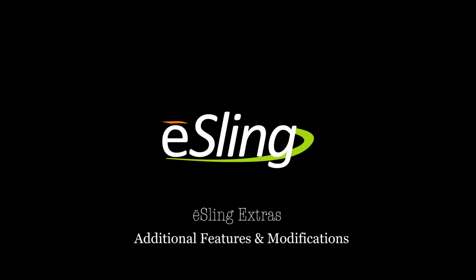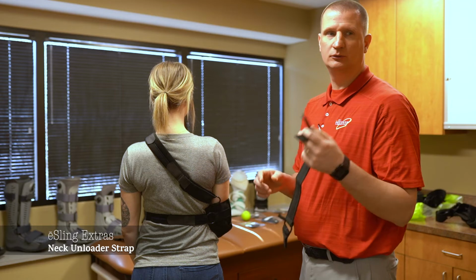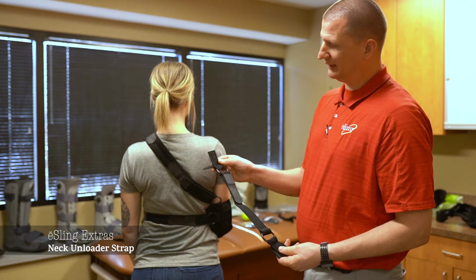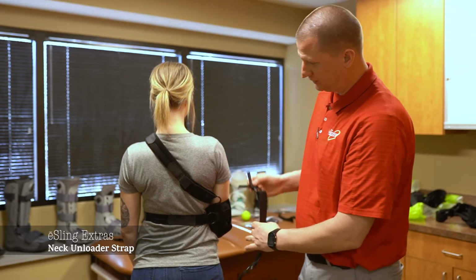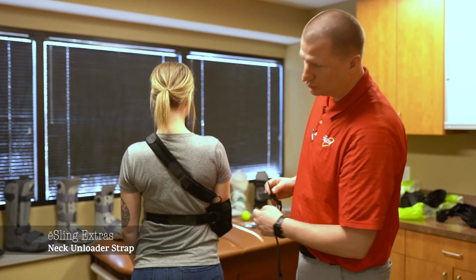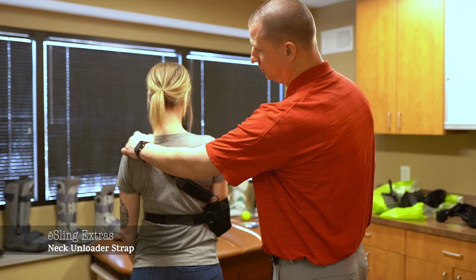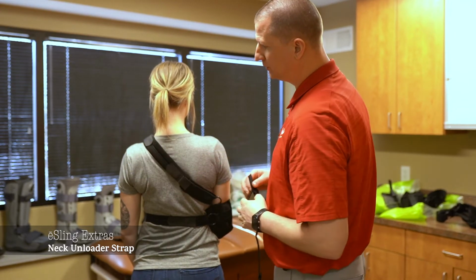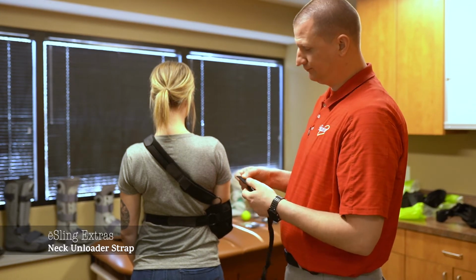Both the eSling Express and the eSling 520 come with an optional neck unloader strap. To apply this strap, it's going to be by color, to where the teal is going to match up with the crossbody strap, and then the navy blue, or the darker blue, is going to attach to the waist strap. What this strap is going to do is pull this away from her neck, hence unload her neck, and get the pressure more over the shoulder, which is adequate to take that pressure.